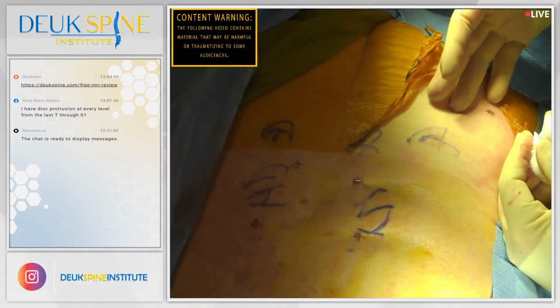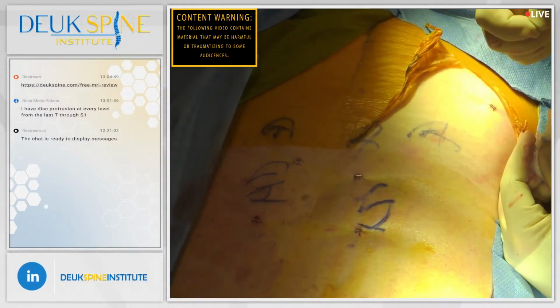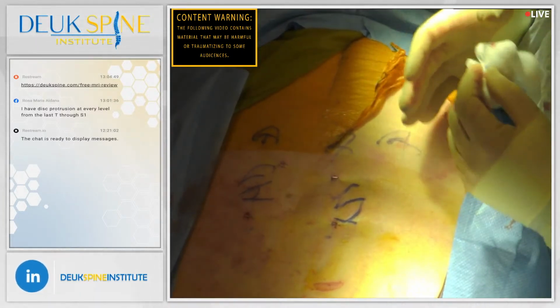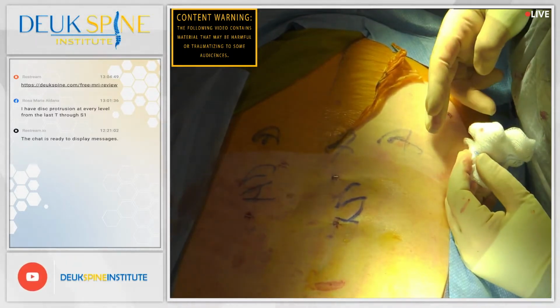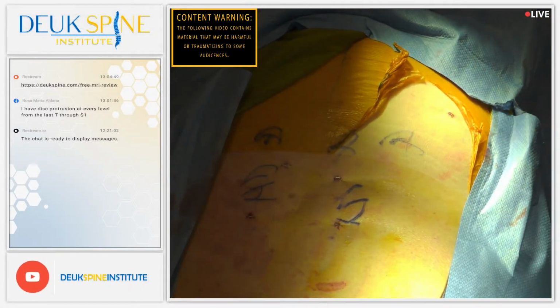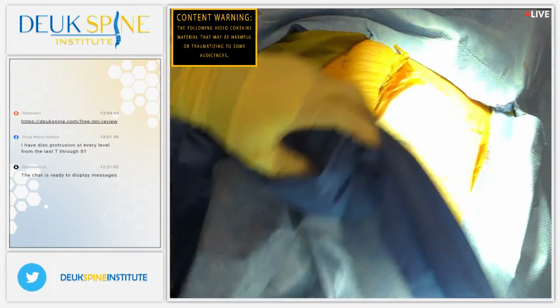And you can't see the muscle, but when I'm releasing it, you can feel scar tissue within the muscle. That scar tissue shouldn't be there. Muscles normally don't have scar tissue in them. The fact that it has scar tissue tells me that that muscle has inflammation, and it's developed scar tissue over time. The scar tissue tracks along the direction of the muscle fibers towards the top of the hip. That's where we release it.